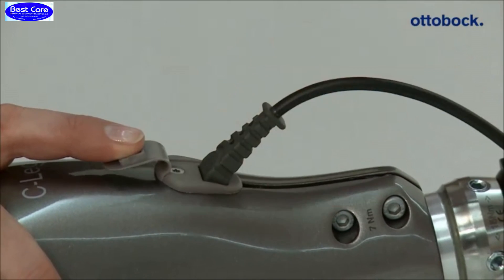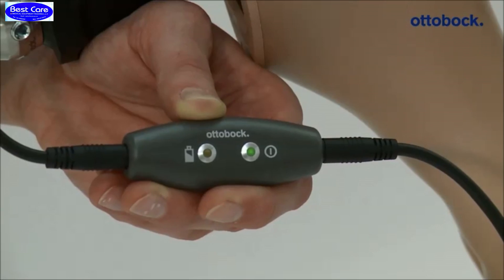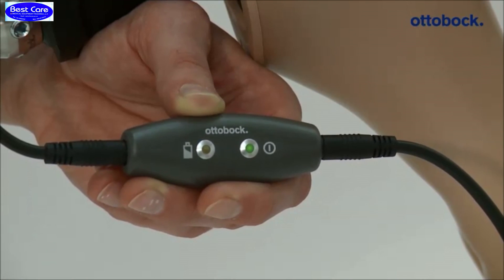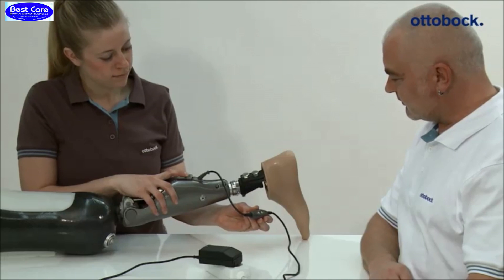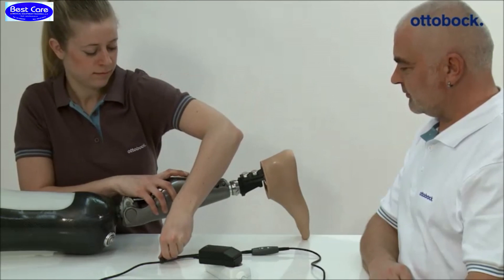After charging the knee joint, the charger has to be unplugged. The joint performs a self-test. The prosthesis is ready for use when you can hear one beep and one vibration signal.